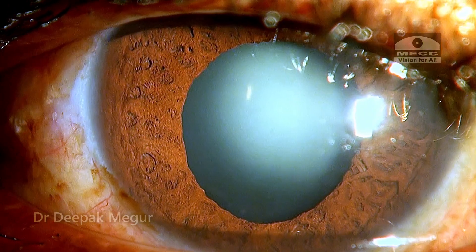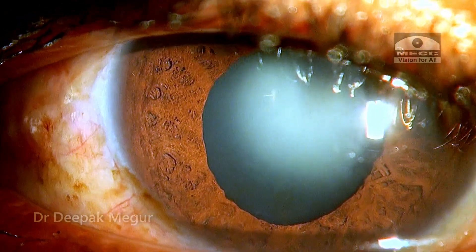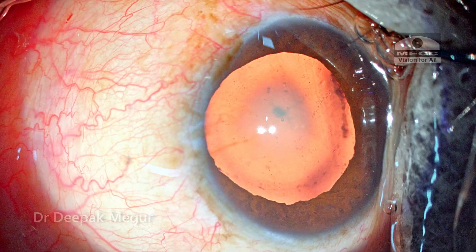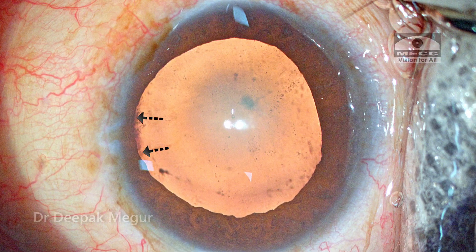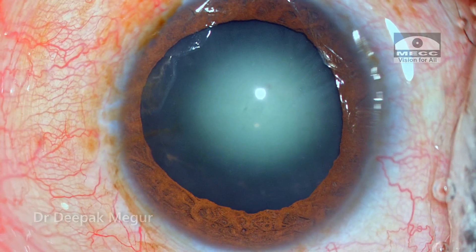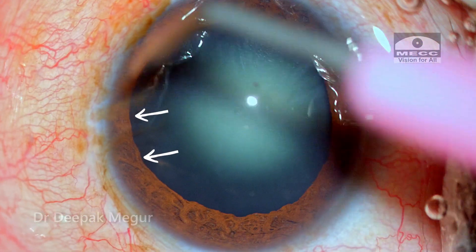The phacodonesis is not very marked and I don't expect any major issue intraoperatively. On the operation table we can see that the pupil is very well dilated and I can see the zonular insertion in the inferior quadrant. The equator of the lens is very much visible here, so I expect the zonules to be weak in this quadrant, although not much.